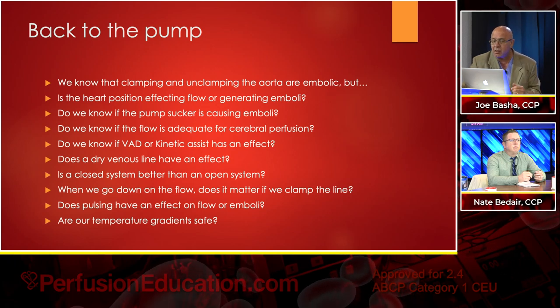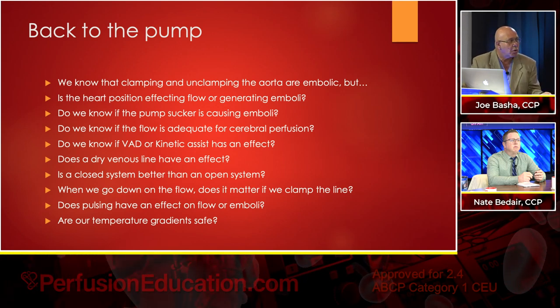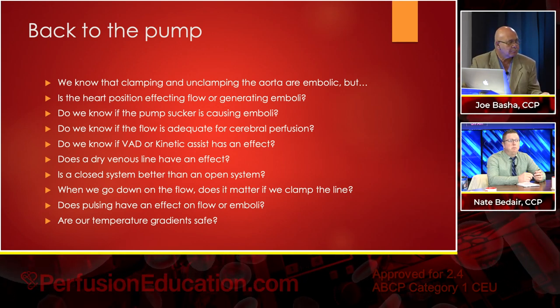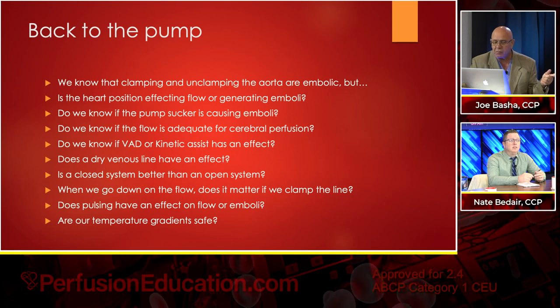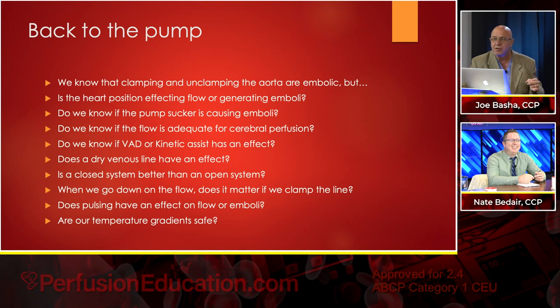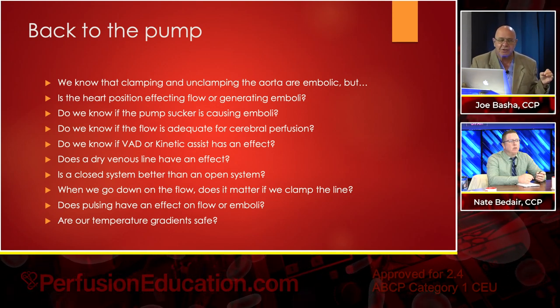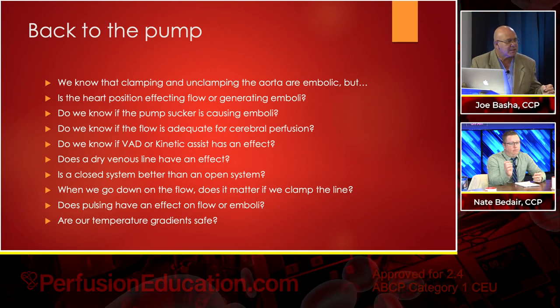When we go down on the flow, does it matter if we clamp the line or if we turn the flow down? I'd like to get your opinion on that one in particular. Me too. What's your opinion, though? Does pulsing have an effect on flow or generating emboli? That's another question. And are our temperature gradients during cooling and warming really safe?